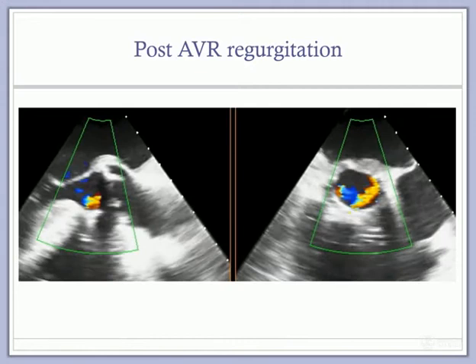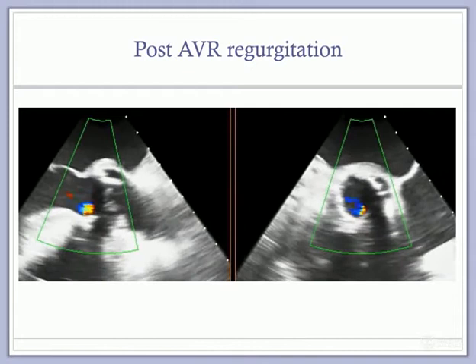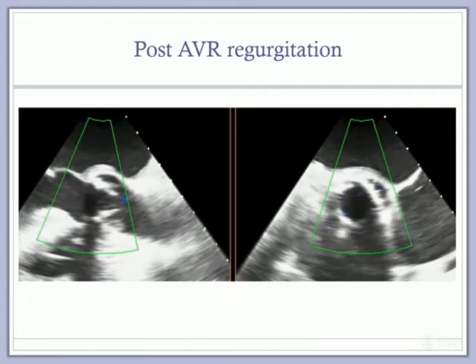This is an example of paravalvular leak post-aortic valve replacement. It could have been due to stitches cutting out or to annular calcification preventing a snug fit of the valve. Whether regurgitation requires stopping the heart again and reoperating or reopening depends on the degree of regurgitation. It's usually eccentric and hard to assess. The site of the regurgitation, the age of the patient, the time already spent on bypass, and whether or not the surgeon feels any improvements are possible all matter.